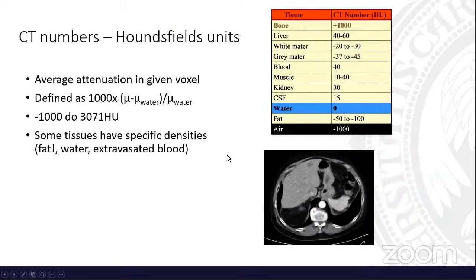Okay. Well, what the CT actually does is that it takes the human body and divides it into small cubes, which are called voxels. It's like a pixel in a picture, but a voxel is in the volume. That means it has three dimensions, and the voxel is a really small cube, and it counts how much each voxel of the body diminishes the X-ray radiation, the X-ray exposure. So all we have from a CT is a really big amount of numbers, one for each voxel of the body. And the number tells us how much each voxel of the body diminishes X-ray.